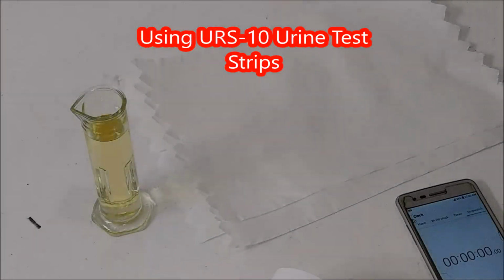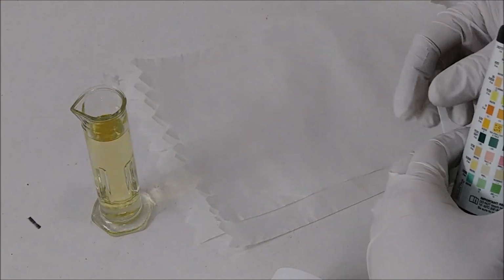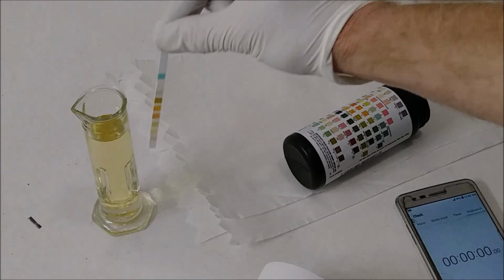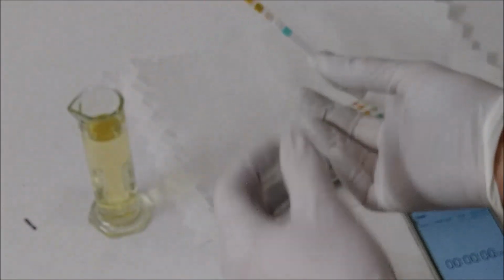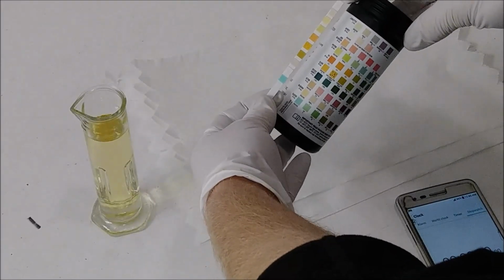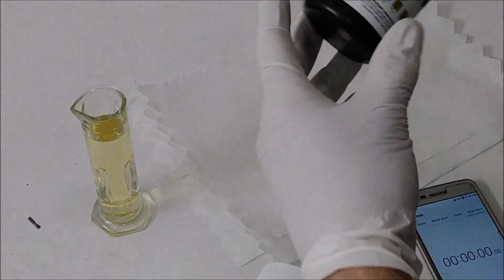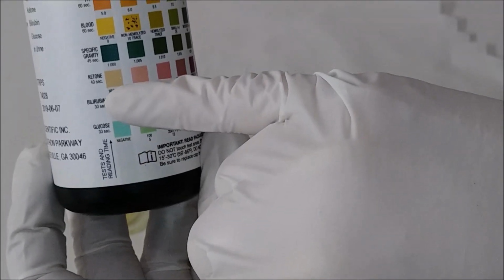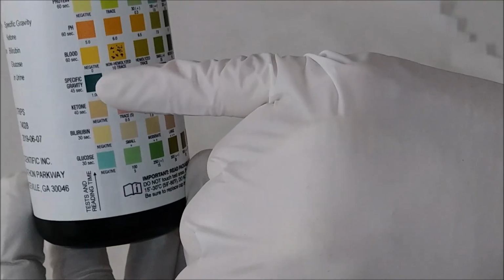For this portion of the test, we're going to be using the URS 10 test strips. What you're going to want to do is take out a test strip and dip it into the sample and do not swirl it around. Then you're going to want to compare each one of the test strips at the timestamps labeled on the side of the bottle. You can see on the side of the bottle at 30 seconds we have glucose and bilirubin. 40 is ketones. And then at 45 we have specific gravity.